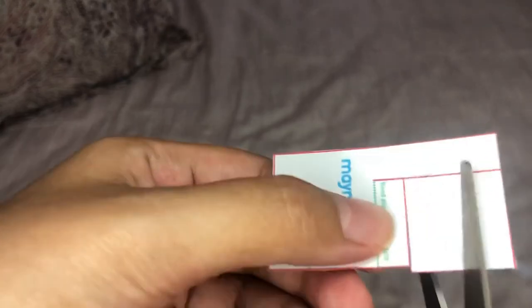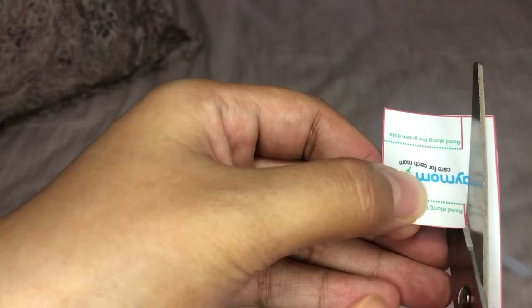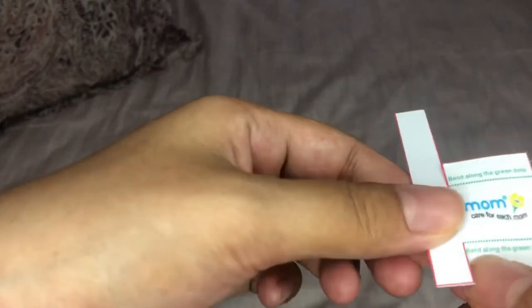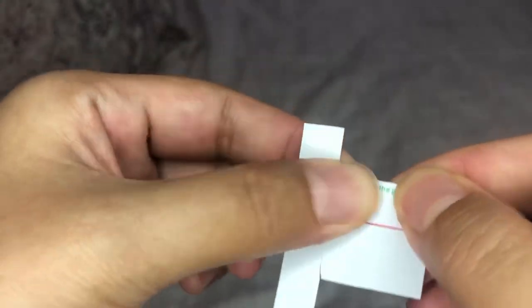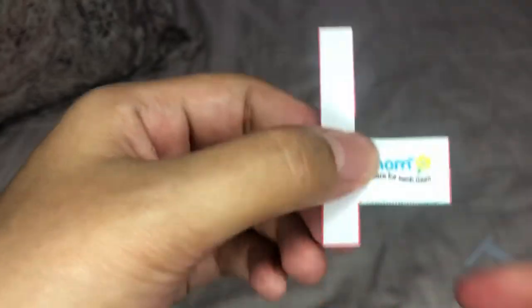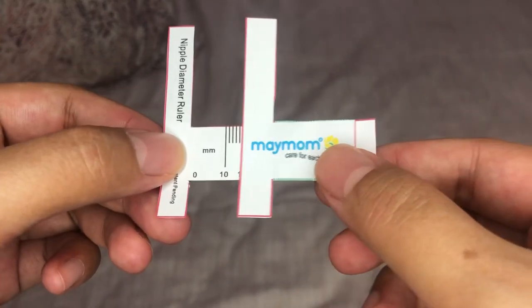Alright, so you have the first part ready. Here's the second part. It says bend along the green dots, so we're going to fold that. There's another green dot. So now you have the second part. You take the first part and you insert it like this. And there you go — you have your own nipple diameter ruler.